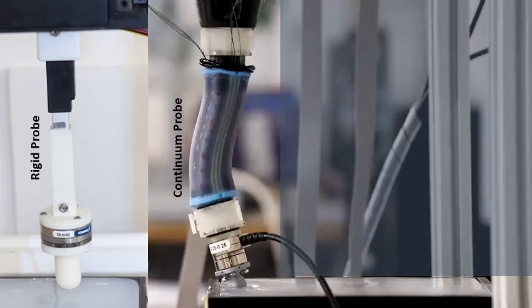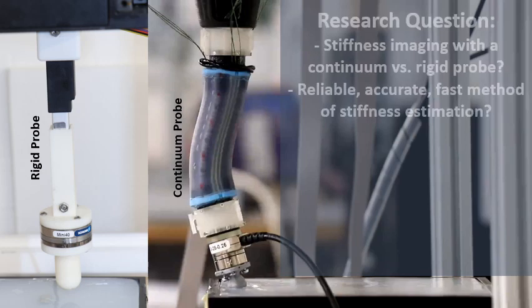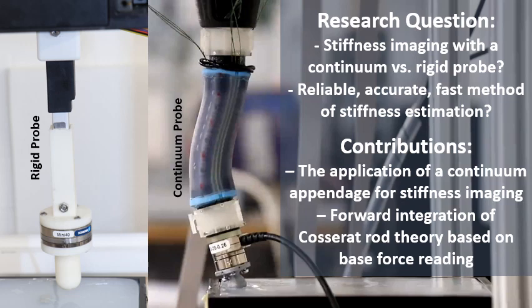Our research questions and contributions. The questions are if we can do stiffness imaging with a continuum probe and how it compares versus a rigid one, and what is a reliable, accurate, fast method of stiffness estimation if we use a continuum probe. The contributions are the application of a continuum appendage for stiffness imaging and introducing forward integration of Cosserat rod theory based on base force reading.